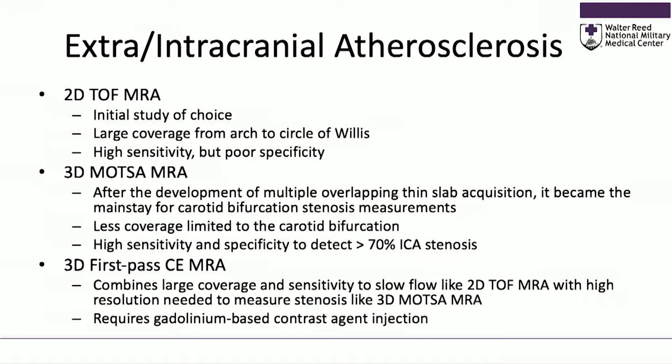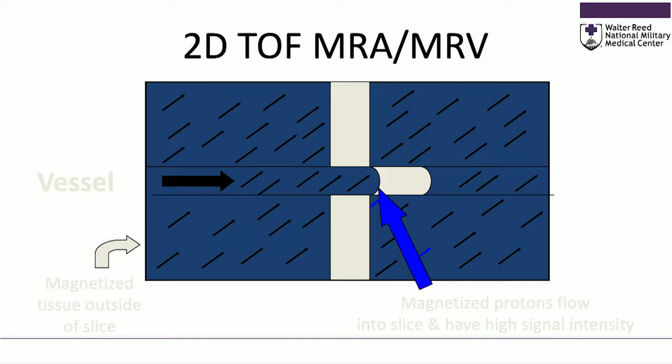Then the next set of techniques that were developed was the first pass contrast MRA, and it kind of combined the best of both worlds. So this is my schematic, and none of that came over very well. Okay, you get the basic idea.